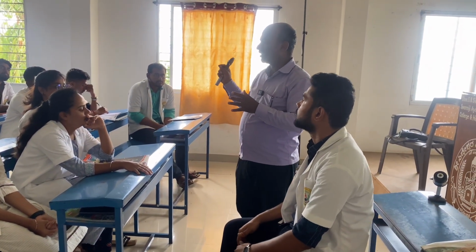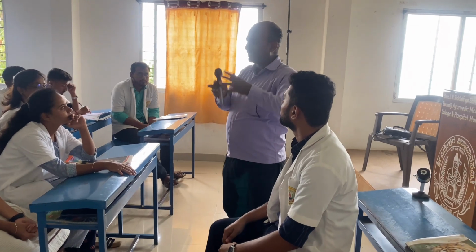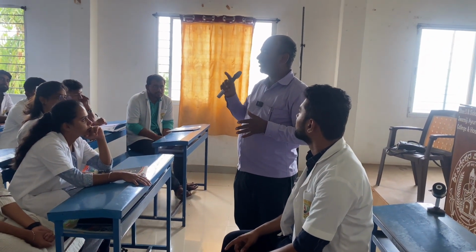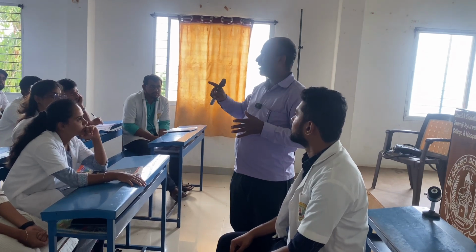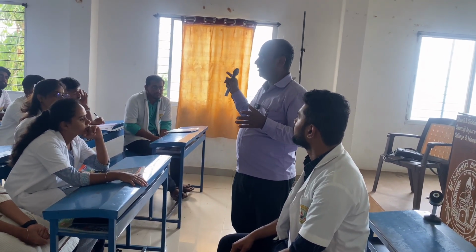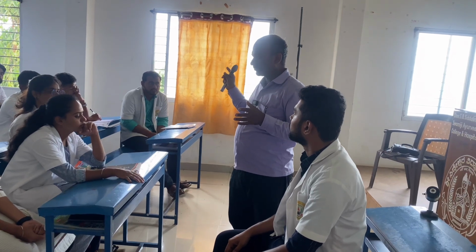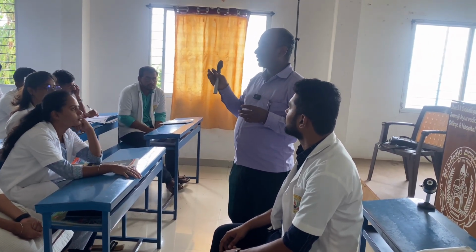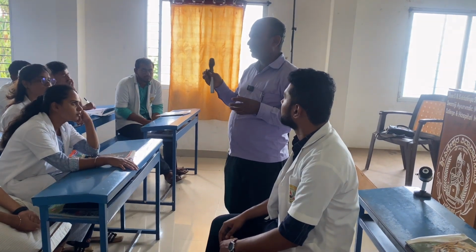Neovascularization. New vessels arise. If they are at the optic disc, then it is called NVD, neovascularization of the disc. If they are elsewhere, away from the optic disc, then it is called NVE, neovascularization elsewhere, right? There are a few dots, right?